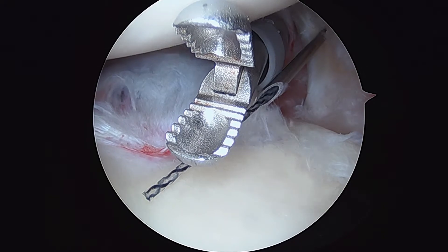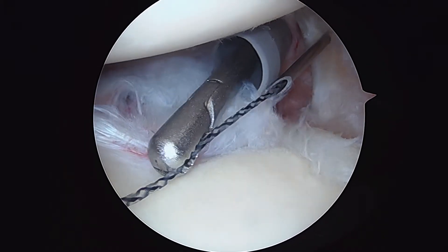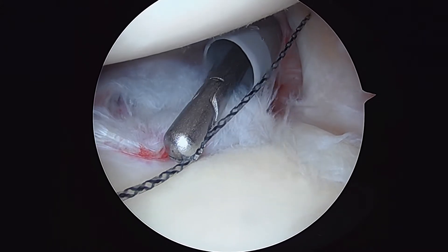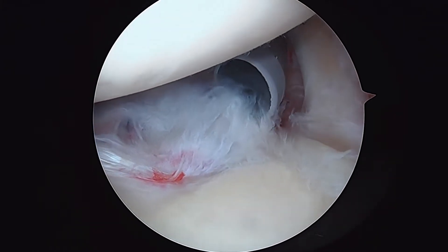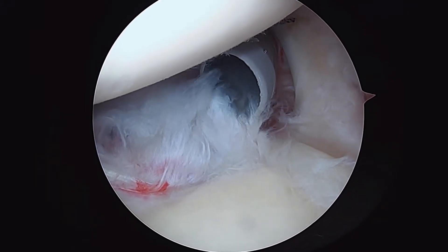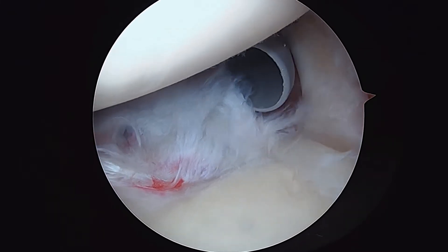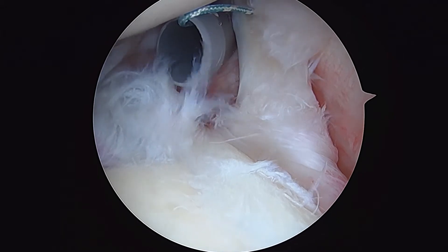We'll pass a little bit more through, and then we can grab it here. We'll back the needle out. Now we're going to load that with a suture that we already have. There's a little hole in that black wire — actually three little holes in the black wire — and that's what makes it a shuttle. As we pull back, you'll see that suture going through.